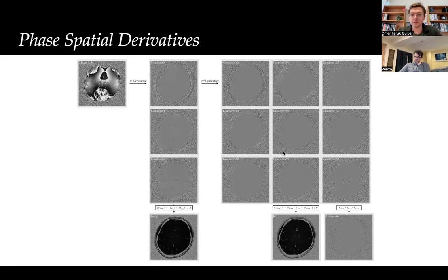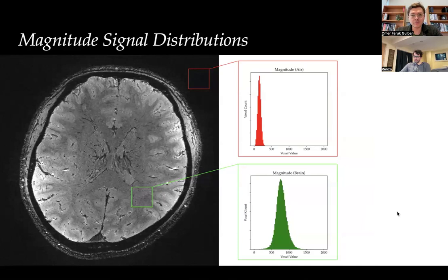because every voxel has a value measured in the second spatial derivative. So okay, then with Tyler, Renzo, and Peter and so forth talking about it, I made the connection that, oh, these things are actually similar. So let's maybe try to think about it and let's see how they work out in the fMRI context, this second spatial derivative of the phase and what it means and so forth.